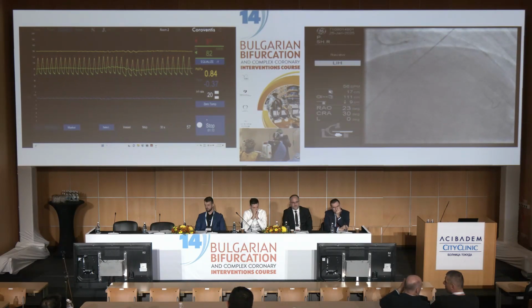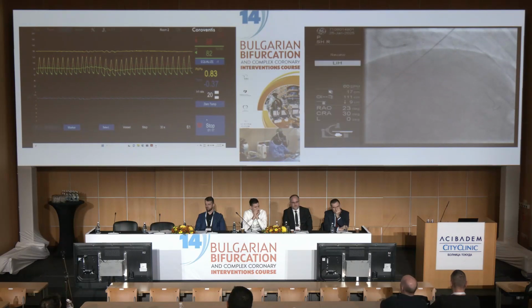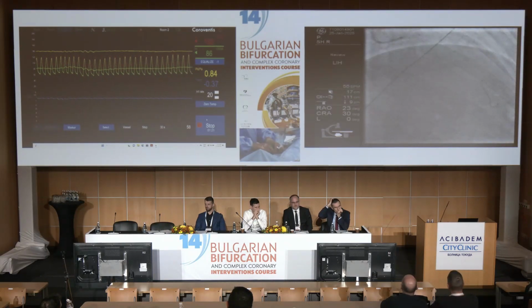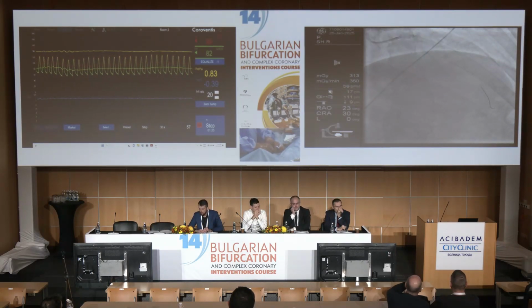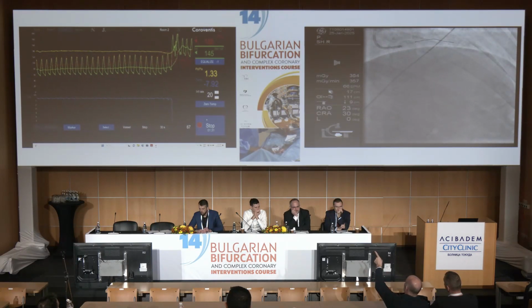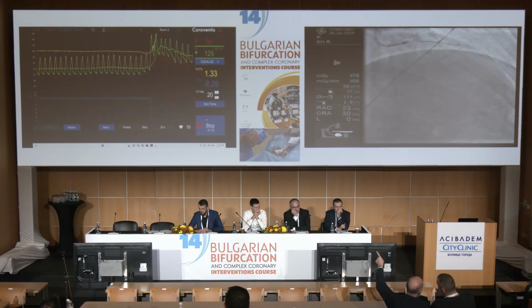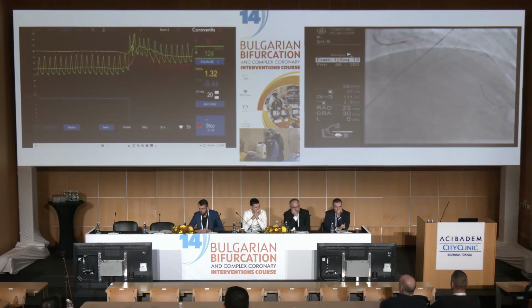And I will ask now, while recording, Valérie, to pull back again the wire in the exact same manner. Film this. It's better to film this. And 1, 2, 3, go. Go. Stop just this time. Stop. Oh, we are just off screen. That's not a problem at all. You have seen that the signal has disappeared, but we have the values. They are here on the screen.